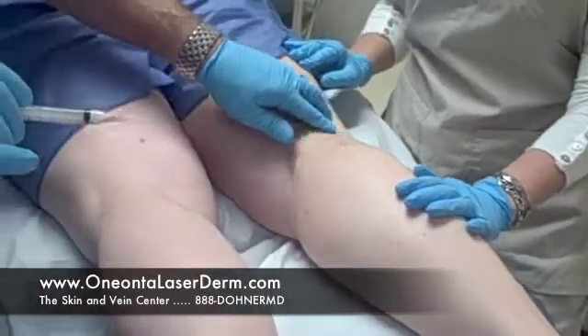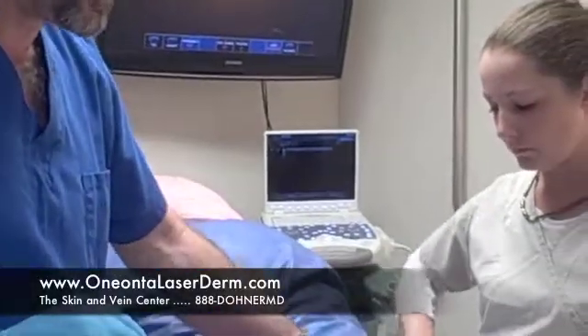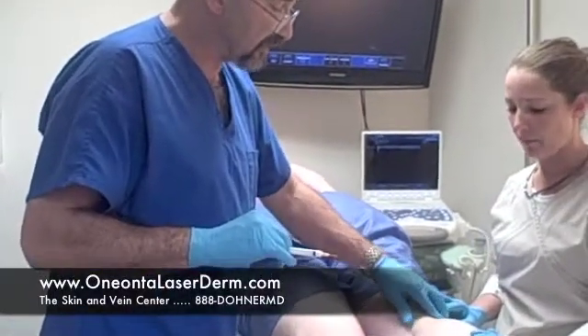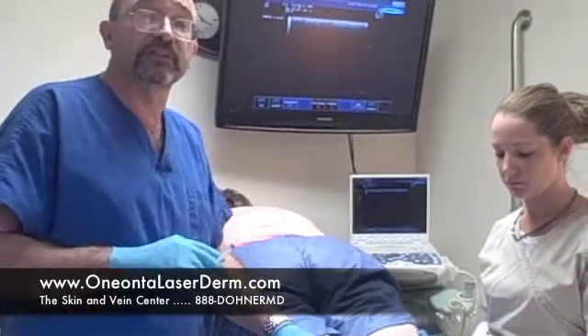You can see how easy this is. She will wear some compression hose for approximately 24 hours, then take them off, take a shower, and wear them from morning until night for another week. She'll come back in about 10 to 14 days — we'll re-scan her and see if we have to do anything else. This is Dr. Eric Dohner from the Skin and Vein Center in Oneonta, New York. If you have any further questions, go to our website at OneontaLaserDerm.com or call 888-DOHNERMD. Thanks.